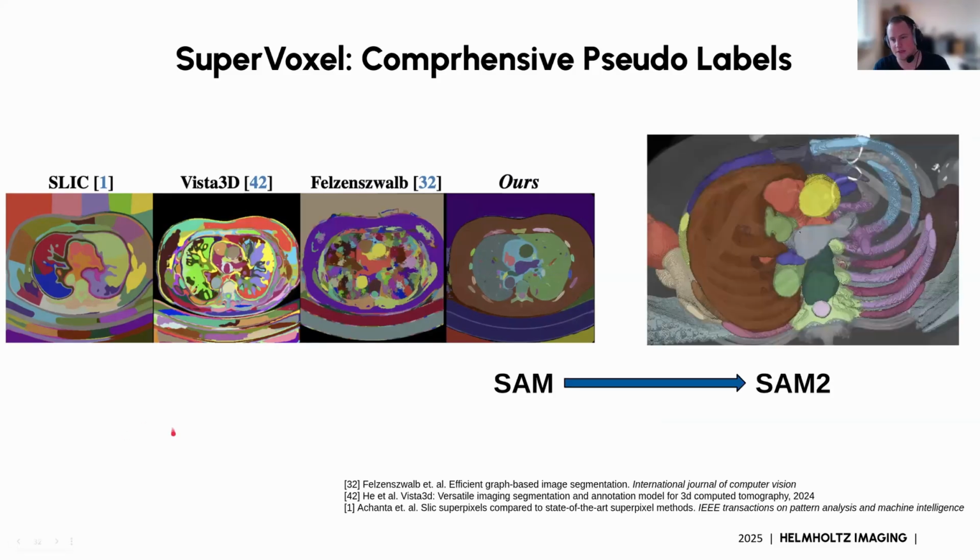And what we did here is basically hitchhike off of SAM2's success. One of the big things that SAM2 introduced was consistency across slices. In SAM2, this is done for videos, but we can also extend this concept to 3D images. And here, Max really put in a lot of effort configuring and heuristically selecting or discarding automatically generated labels by SAM2.